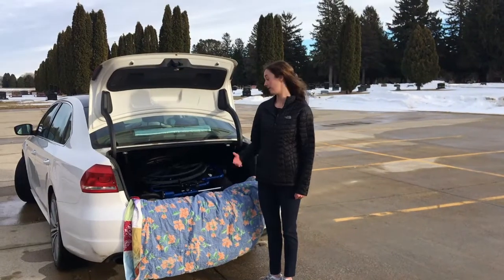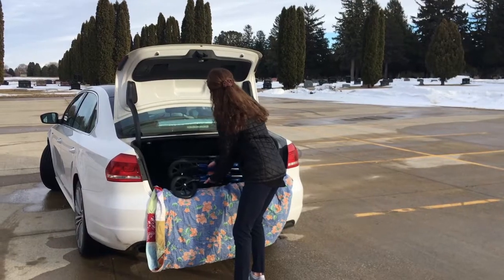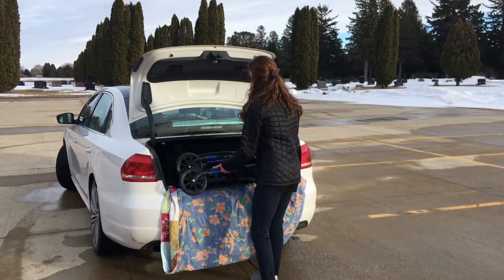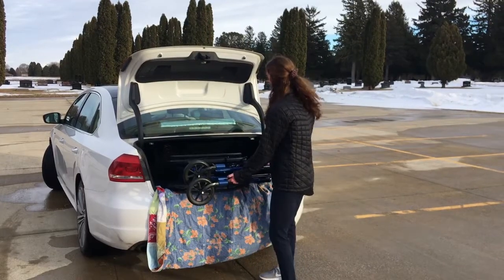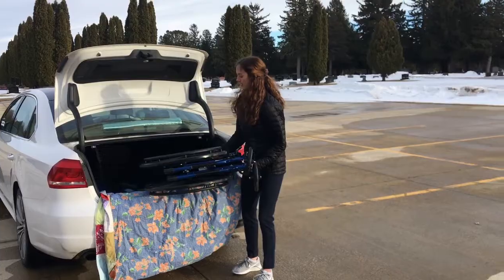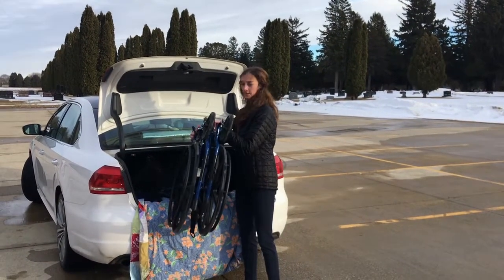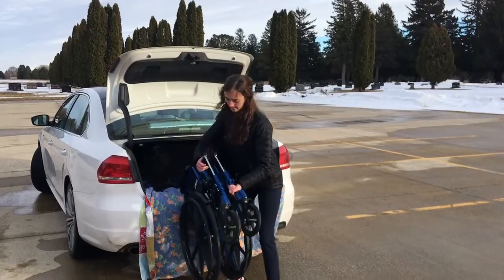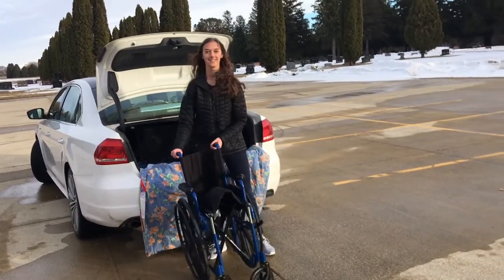Unloading the wheelchair is similar to loading it in. Grab near the wheels and shimmy it out. Then twist it over and tilt it back up, and ease it back down. Voila!